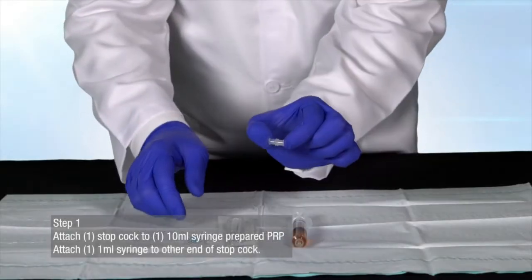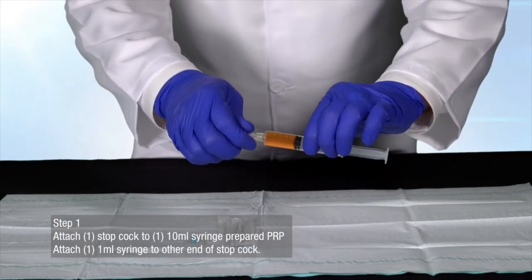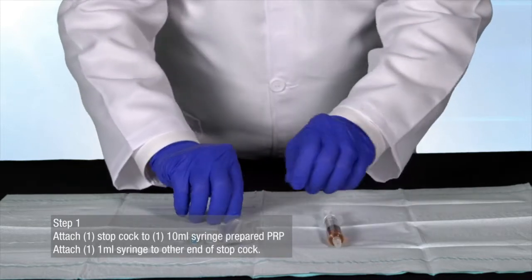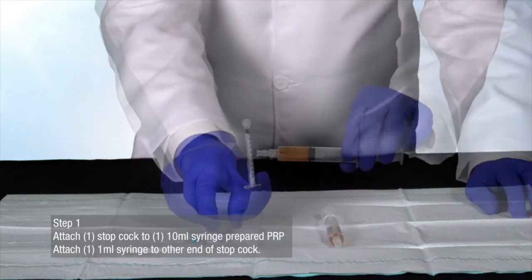Begin by attaching one stopcock to your 10 milliliter syringe of prepared PRP. Then take a 1 milliliter syringe and attach it to the other end of the stopcock.